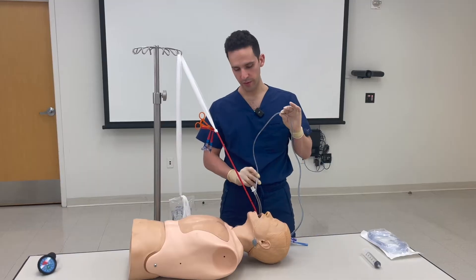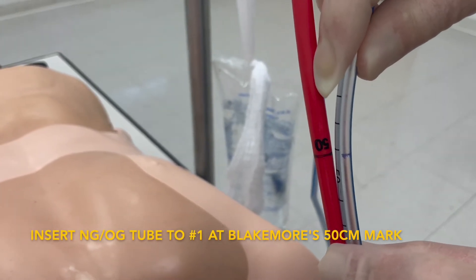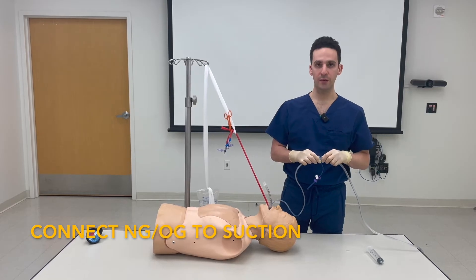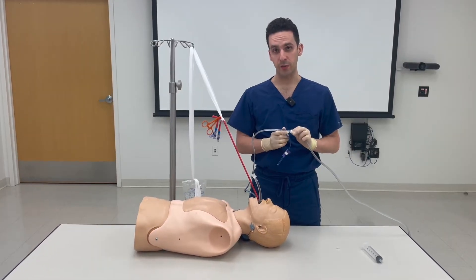Take your NG tube and pass it until you align the number one with the 50 centimeter mark on the Blakemore. Connect your suction tubing to the gastric tube. At this point, if you no longer aspirate blood, that means that you've successfully tamponaded the bleed. If you continue to aspirate blood, you'll need the cufflator to inflate the esophageal balloon.